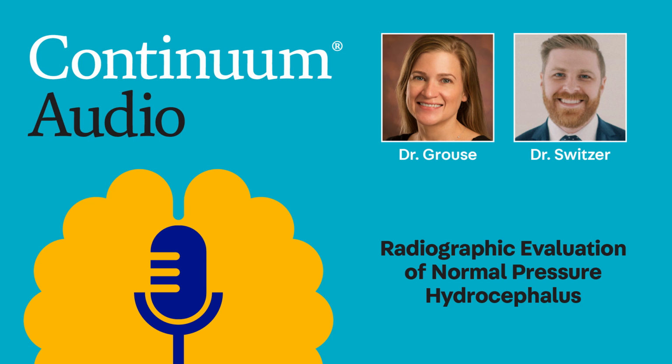That's really helpful. And then on the flip side, any tips or tricks or clinical pearls you can share with us that you found to be really helpful for the evaluation of NPH? One thing that I found really helpful is to look for previous imaging, to look if there were features of NPH at that time, and if so, have they evolved over time?